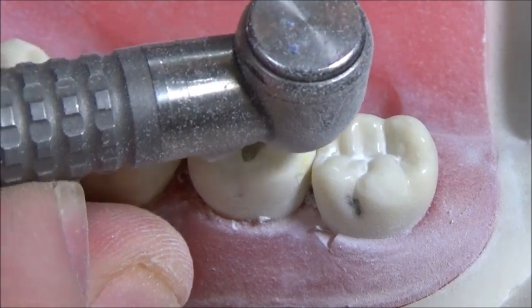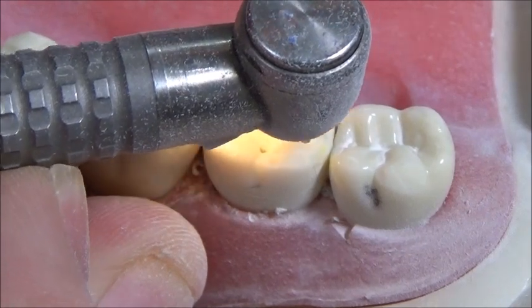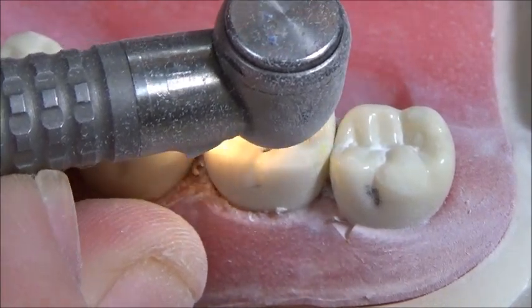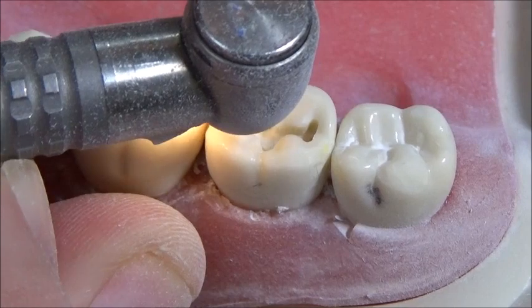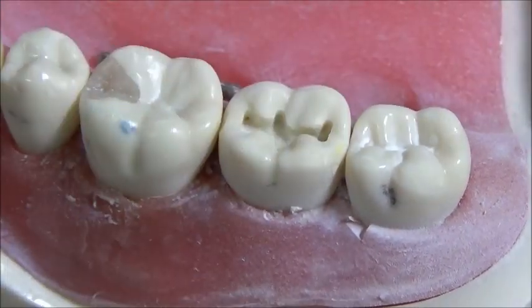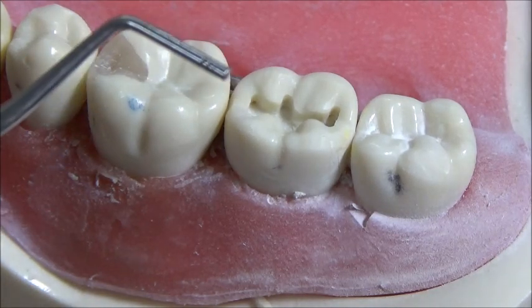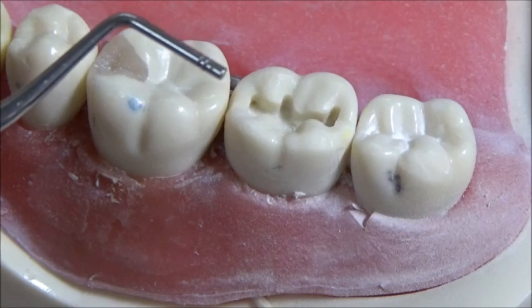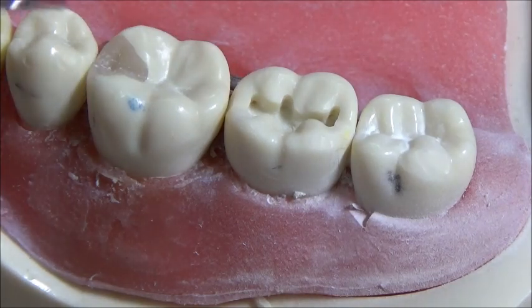You'll want to use a paintbrush-effect sweeping motion to smooth things rather than attacking back and forth. Sweep from the side. This instrument is called the PLG 7044 — it has markings where the one closest to the end of the nib is 1.5 millimeters and the second one is 2 millimeters, so we can use that to check depth.